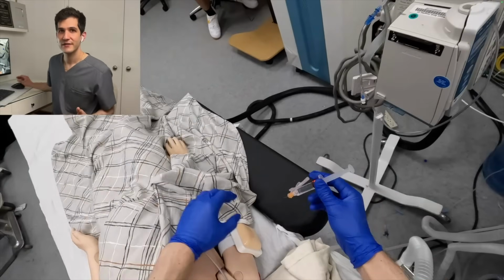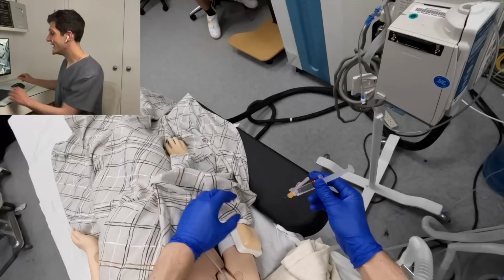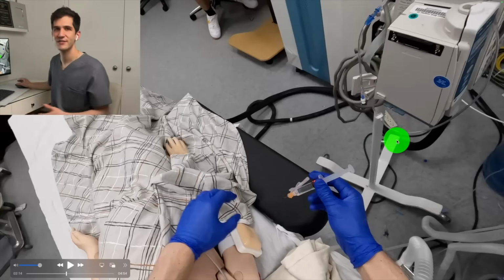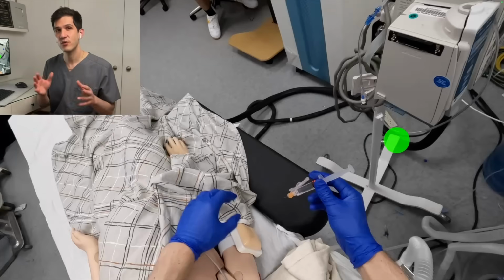That background noise that you hear of the pulse oximeter tone dropping is a terrifying sound to hear and means that clearly there's a problem that needs to be fixed right away. Because when the oxygen saturation drops, then eventually the patient's heart rate will drop and this can lead to a cardiac arrest. So the medication that I've grabbed here is called succinylcholine. And what you can appreciate is that even though we have no IV access for the patient, this tiny needle is an intramuscular needle. So that allows me to deliver succinylcholine, which is a paralytic, even though we don't have IV access. So this is actually one of the key emergency medications in pediatric anesthesia.